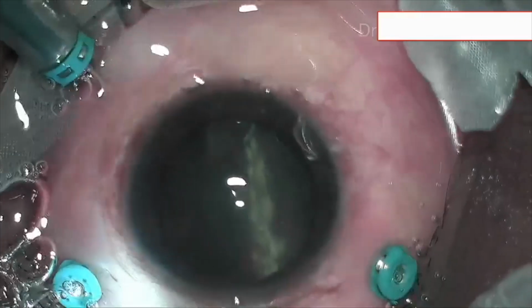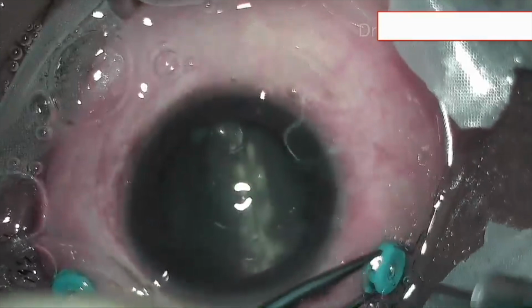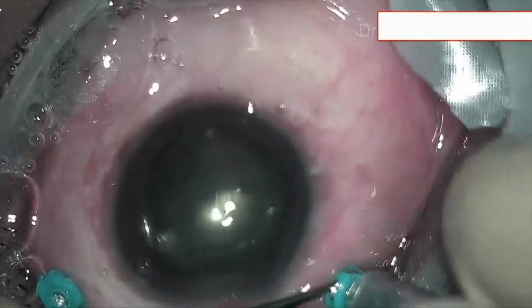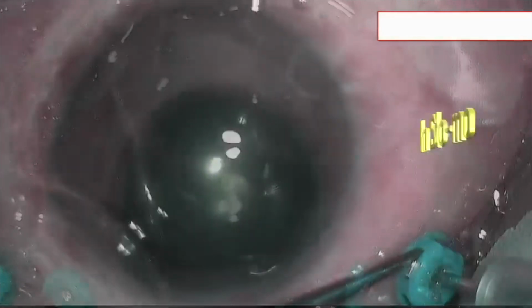I withdrew the air infusion cannula immediately. I was more or less sure about the intravitreal position of the right-handed superior cannula, so I introduced the air infusion cannula through it. Oh, it was magic. The kissing choroidals just vanished.